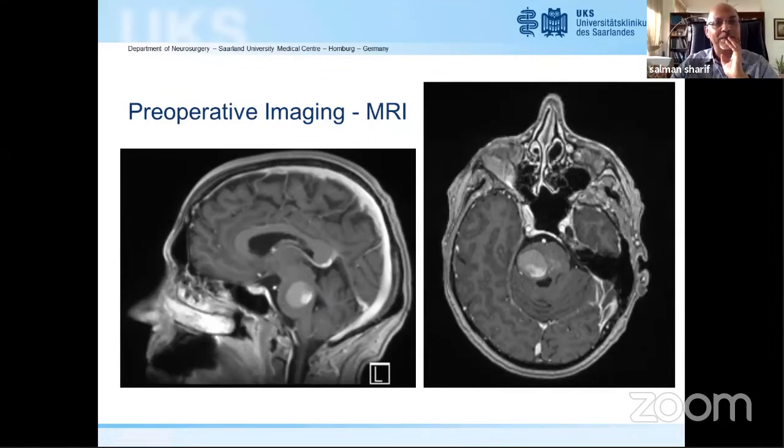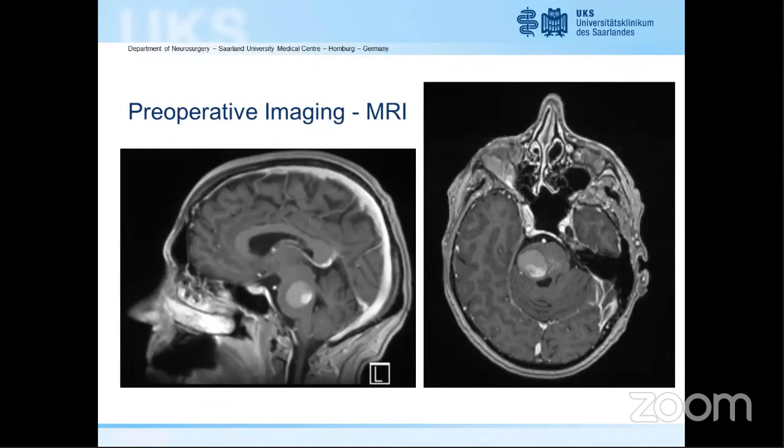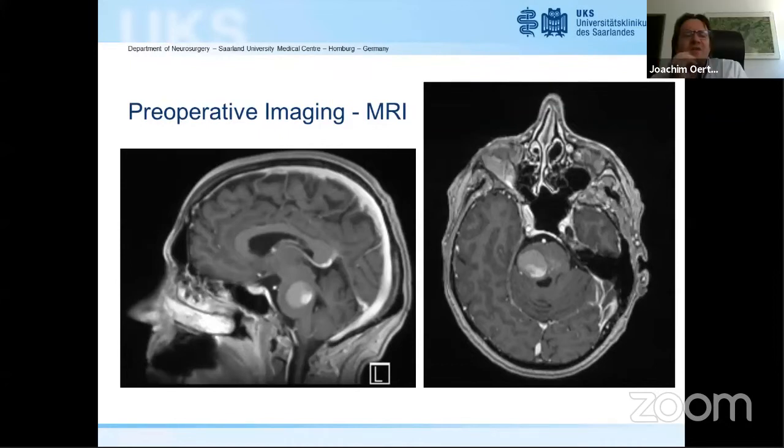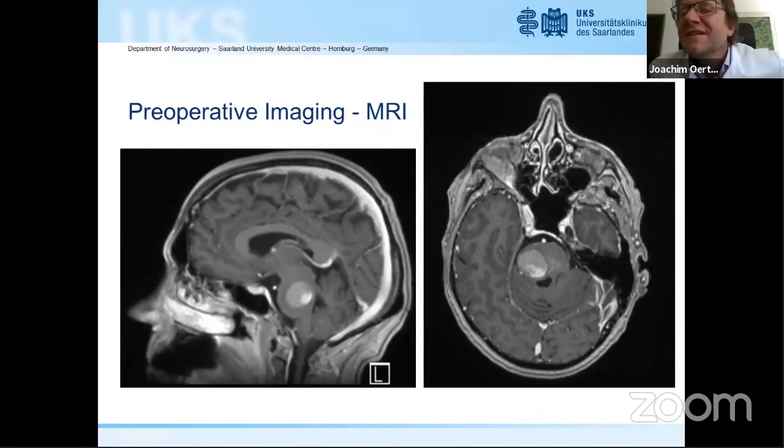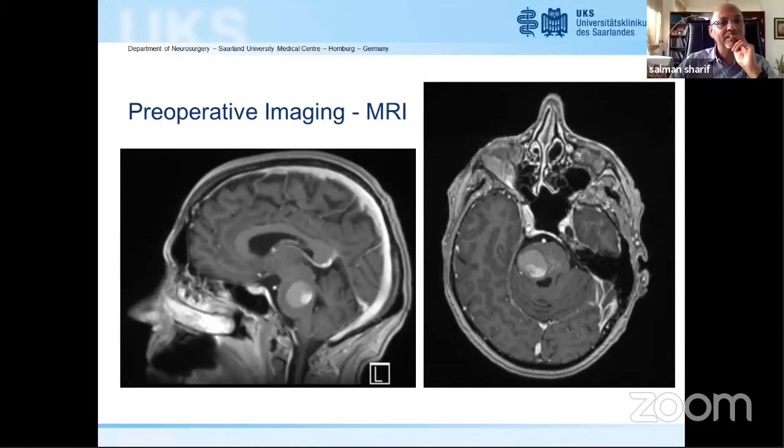Farhan Gulzar wants to say something. In hemangioblastoma, normally we see a flow void in it, a vessel. I can't see a vessel in it. It could be a cavernoma. Why would you see a flow void in hemangioblastoma? In hemangioblastomas, there are vessels in it, and in the nodule, it has a vessel most of the time. I don't agree with this. Okay, so we go to Khalid. I think it's a cavernoma. Very small nidus, you barely see vessels in many cases.